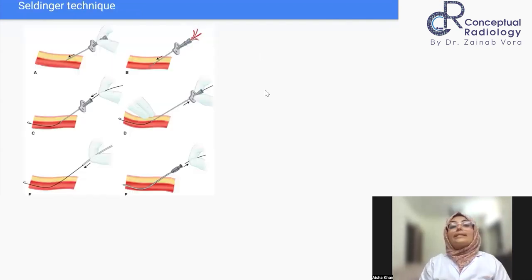Now we come to the historic Seldinger technique, right? So this was given by Sir Seldinger in 1953, and it was one of the most miraculous thing which was given, जिसने spark करा एक wave of interventional radiology across the world that people could not imagine. With a small hole, it is just like a laparoscopy. Like you have laparoscopy, which is completely replacing open surgeries. वैसे ही Seldinger technique is a micro access procedure which is replacing all the open surgeries today. So Seldinger technique is must know. This can be asked in theory, short note आ सकता है, this can be asked in your viva for sure. तो इसको समझते हैं अपन, what is our Seldinger's technique.